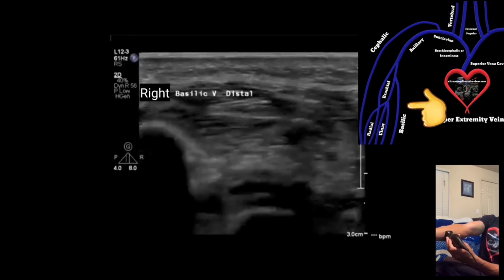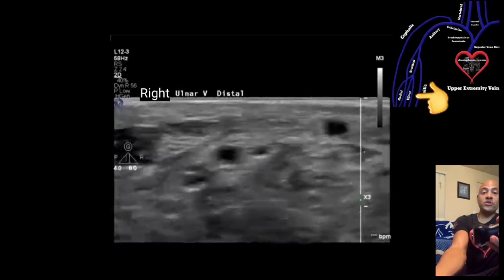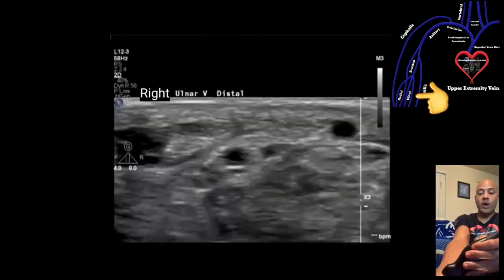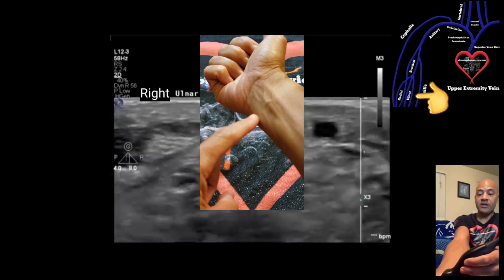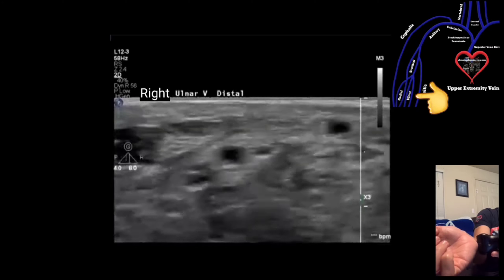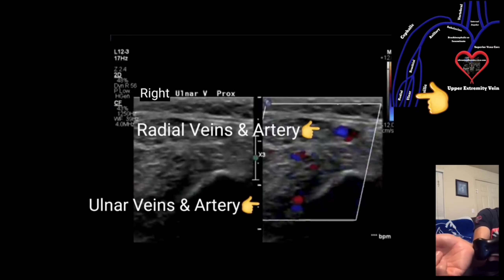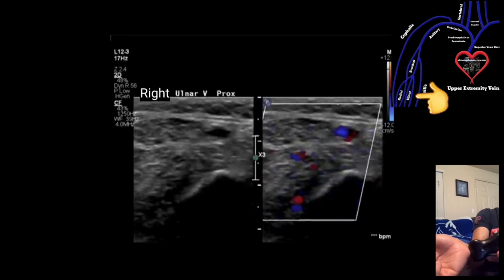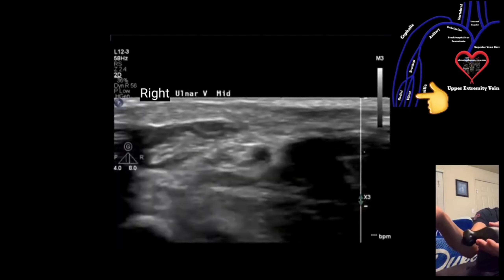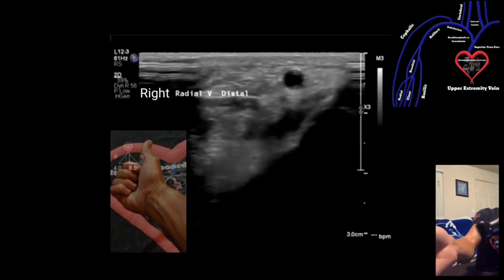Turn back to the transverse view, move distally, and acquire images compressing the basilic vein in the distal region. Next we're going to look at the patient's ulnar veins. Place the transducer in the transverse view with the index pointing towards the patient's right, in the distal region right by the patient's wrist on the medial side. Acquire an image compressing the veins — these are extremely small in most patients, so you may need to use color Doppler to find the ulnar artery first, and then you'll be able to locate the ulnar veins. Compress the distal region, then move to the mid and compress, then move proximally.